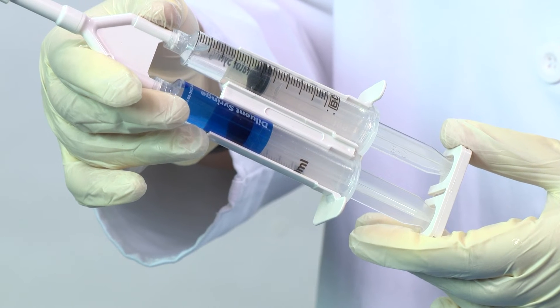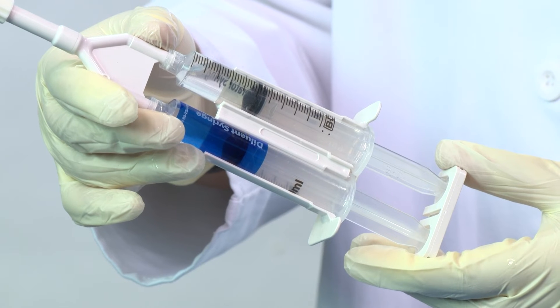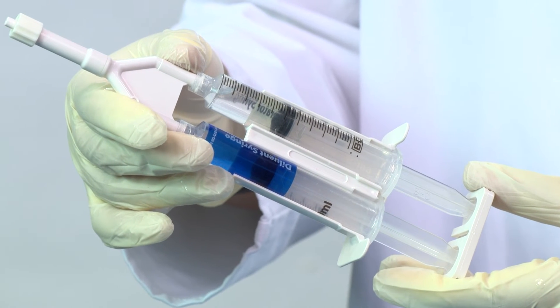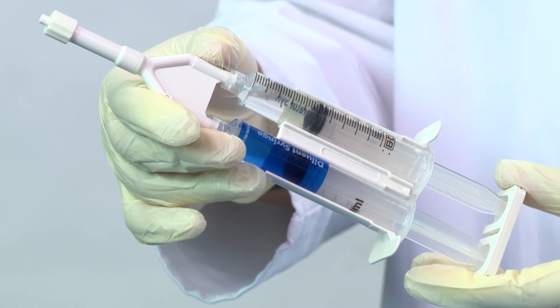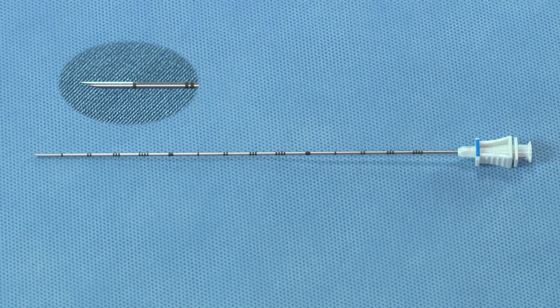The remainder of the kit should be assembled per previously received instruction through training or by referencing the directions for use. A fully assembled SpaceOr Hydrogel delivery system shall appear as follows. Note that during the procedure, the blue marking on the needle hub will be visible when correctly oriented, with bevel facing down.